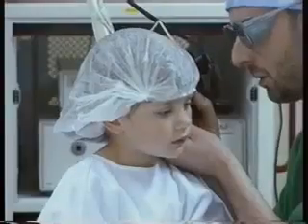Had these patients sought advice prior to our disposing of laser equipment, we would have performed office-based ventilation tube insertion under topical anesthesia. Used as sole management for 60 chronic OME, this technique allowed us to restrict the insertion of a transtympanic ventilation tube to only 5 adult cases out of 31 and 6 pediatric cases out of 29.